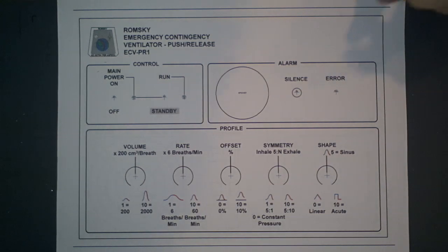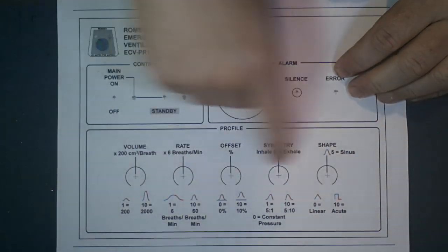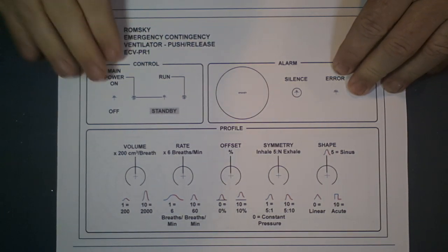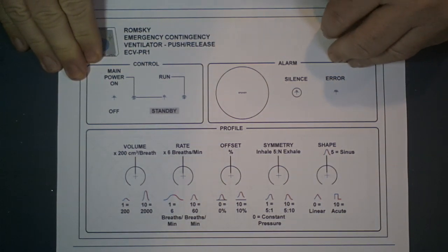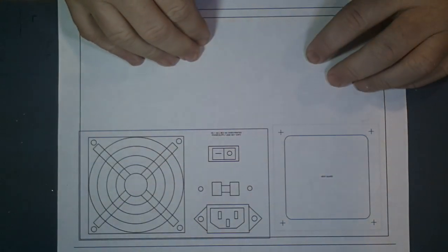But so you can see, it's nice because I can make nice drawings and printouts and show you what the knob settings are and the switch settings. And of course, I always put my little logo up there. I built a couple of these. And the third slide is basically a template for the back.